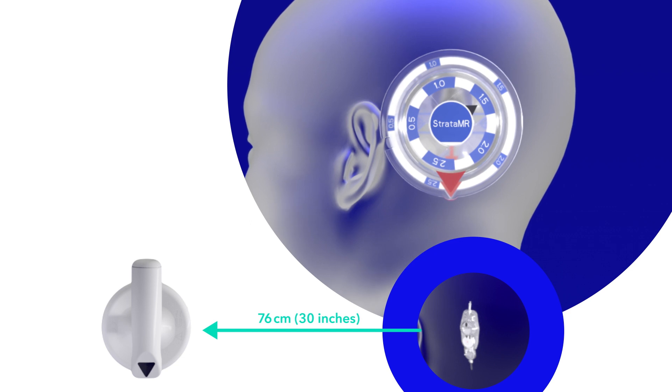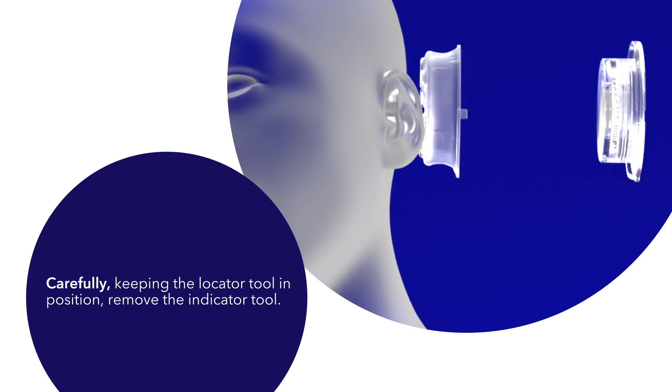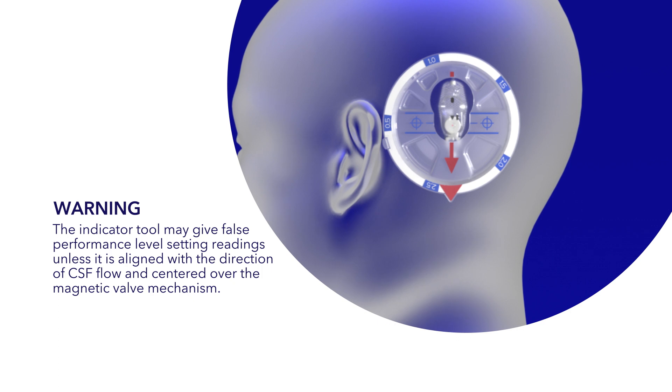Carefully keeping the locator tool in position, remove the indicator tool. Warning: the indicator tool may give false performance level setting readings unless it is aligned with the direction of CSF flow and centered over the magnetic valve mechanism.